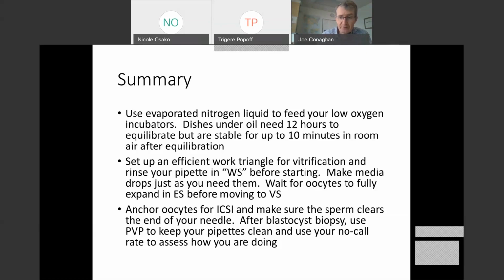And if you do that, you'll have fertilization rates of 85% or better. And then the last thing we talked about was blastocyst biopsy and the tricky procedure of getting little sticky pieces of trophectoderm into Eppendorf tubes. You can use PVP to your advantage here to help you not lose cells during that tubing process. And finally, always pay attention to your no-call rate, because that will tell you what the quality of your biopsies is. And with that, I'm going to say thank you to all of you for listening.